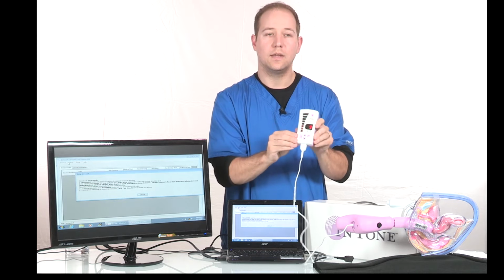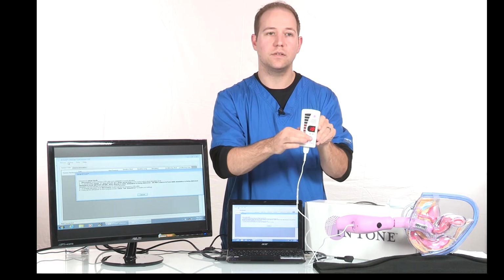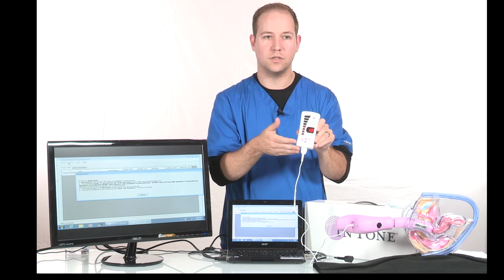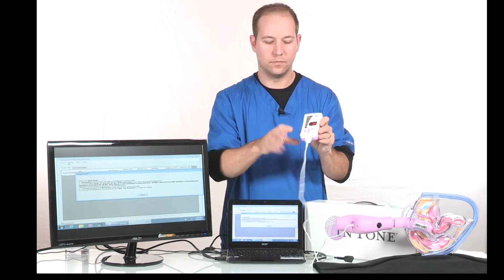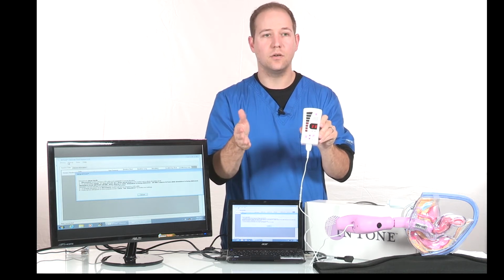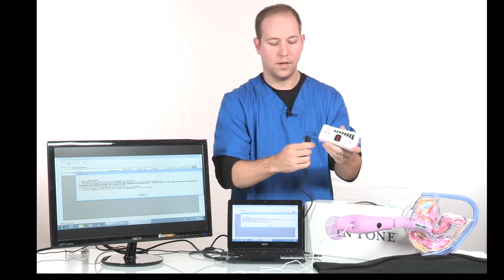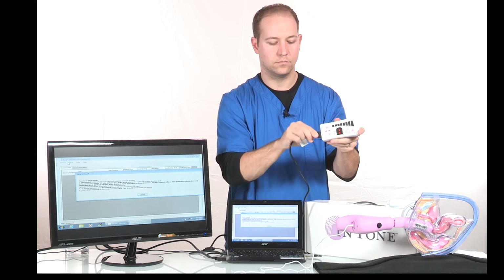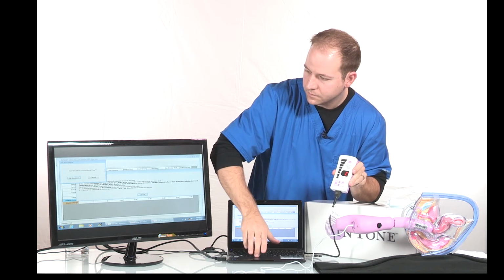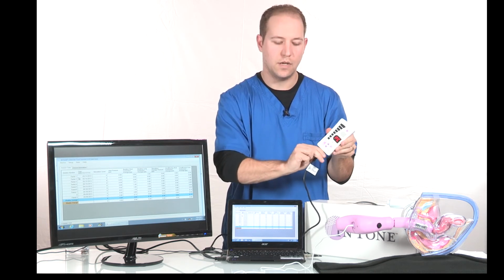the appropriate level. Now, had the patient previously been at a 9 for their electrical stimulation, you will obviously increase it at least to a 10, sometimes to an 11 or a 12, depending on the patient's tolerability of the stimulation level. So in this case, we're going to increase it to an 11, so the patient feels the tingle and then they feel the tug. It's comfortable for them, so you unplug it, plug it back into your computer, and then click on Set Stim. We've now reprogrammed the patient's device after their 2 weeks to a higher stimulation level.